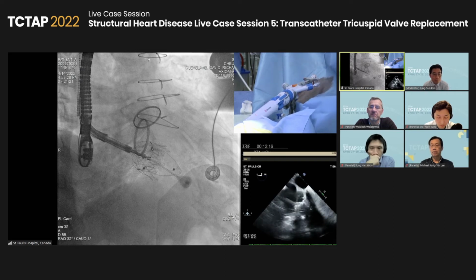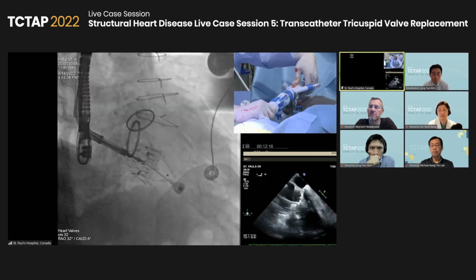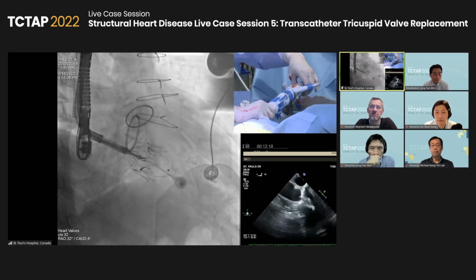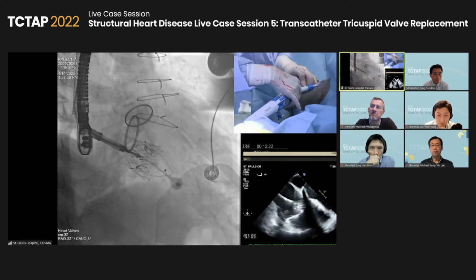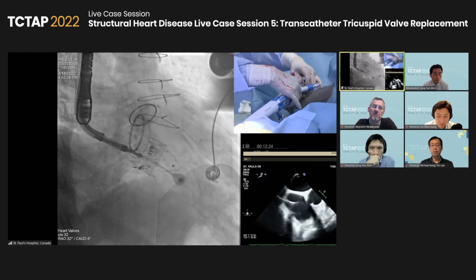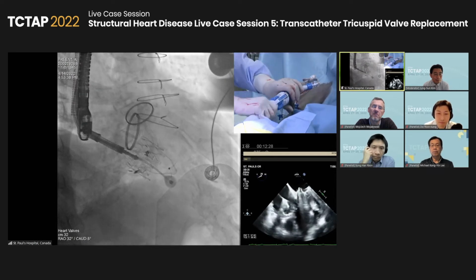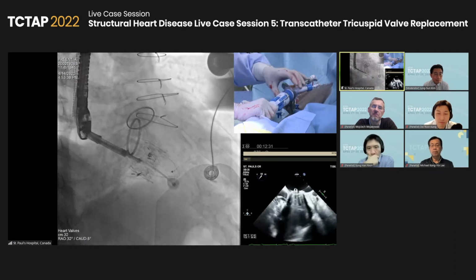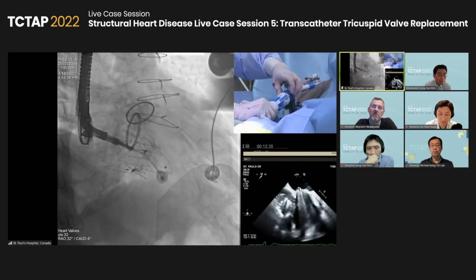I think I would like to actually release the rest of the valve. All right. Can you go for 4-0 or C, doesn't matter? Very good. Okay. Unlock this, and then we'll release the valve. The valve is fully released. Then I'm going to retract this. 4-0, please. Slide fluoro. Yep. Thank you very much.